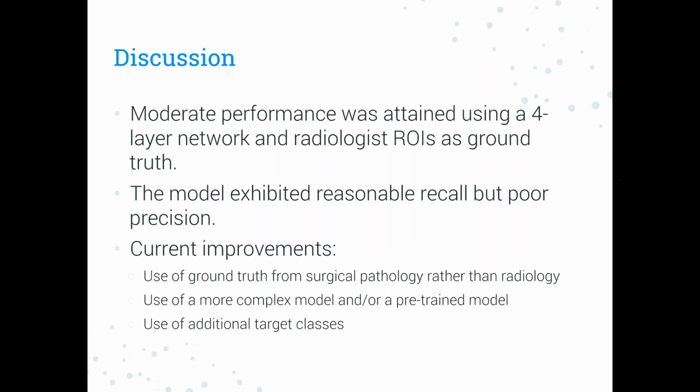So a few things to know. We got moderate performance using our 4-layer network, but we got reasonable recall. We got poor precision, so we had a lot of false positives. We're currently improving this with more data.